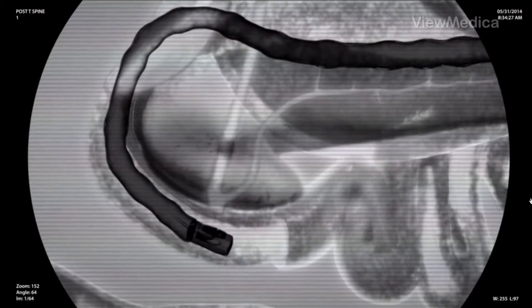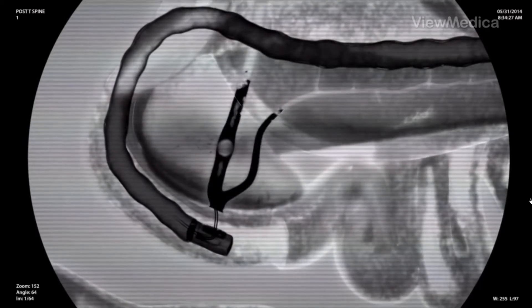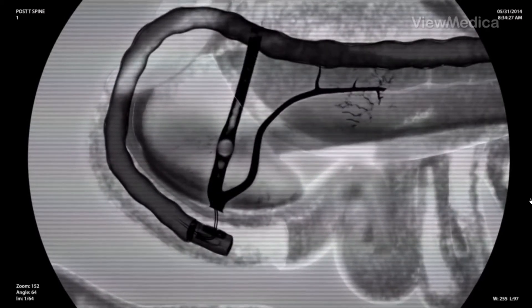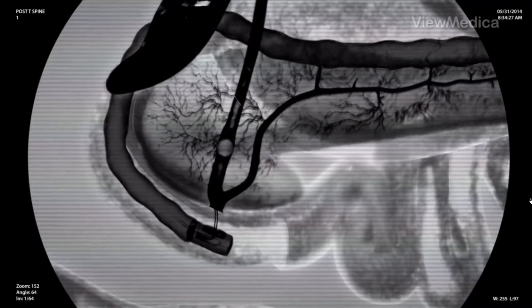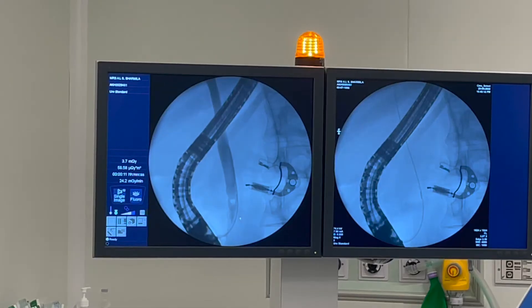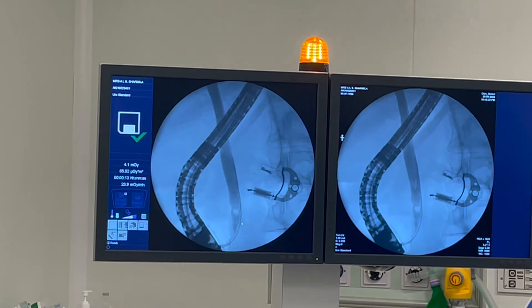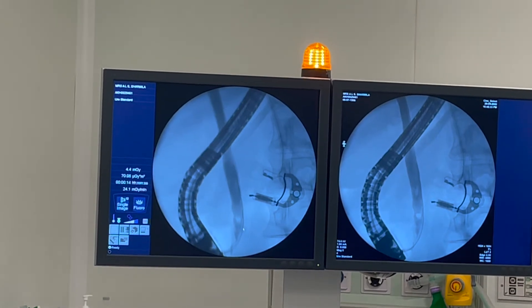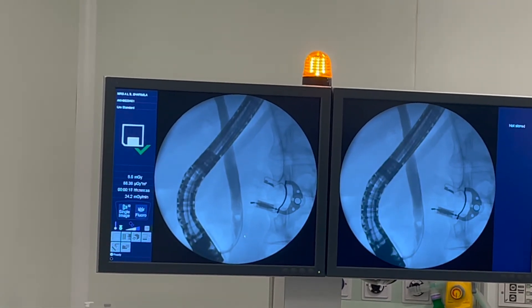The doctor injects a special dye, also called contrast medium, into the ducts through the catheter to make the ducts more visible on x-rays. Then uses a type of x-ray imaging called fluoroscopy to examine the ducts and look for narrowed areas or blockages.